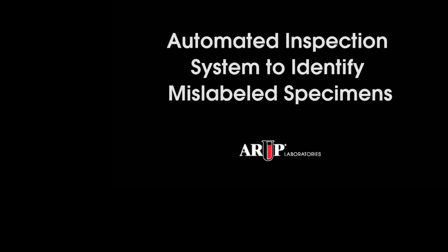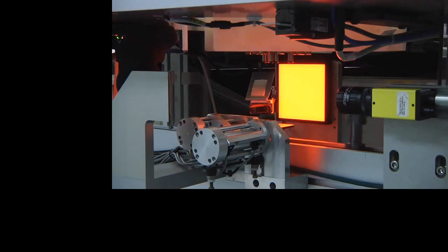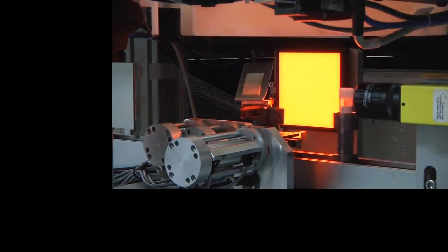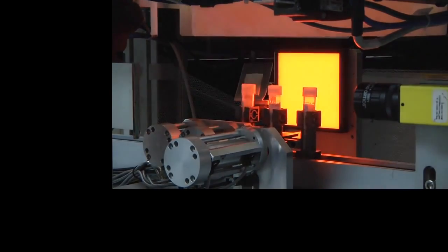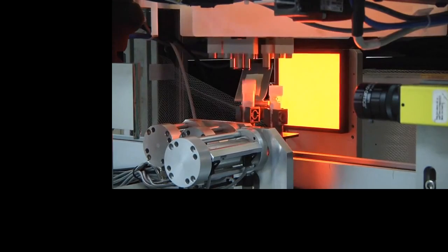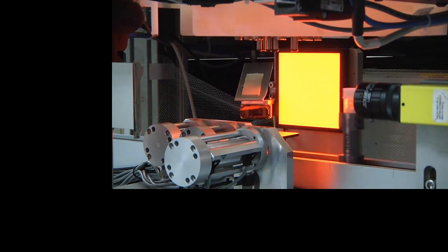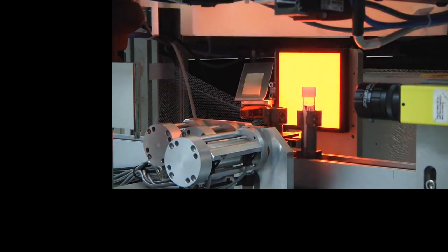This video clip shows the operation of the system that was developed to detect mislabeled specimens. As shown in this scene, specimens are being transported in carriers on our automation system. They are stopped at a precise point, enabling a robot to pick the tubes out of the carrier and lift them up to the vision system. This stopping point is directly in front of a red backlight, and with the aid of a 45-degree mirror, a smart camera, which is shown in the right foreground, measures the tube's height and the diameter of the cap. This enables the robot to securely grasp the cap and lift the tube.